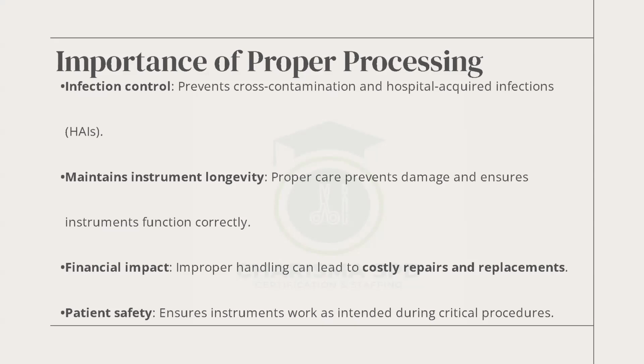All right, and patient safety. If you don't process the complex instrument well, you cut corners and you leave microorganisms or bioburden, you infect the patient, and then the patient has to come back and can sue the hospital, so the financial impact comes into play, and the life of the patient is also being impacted negatively. So when you go to the job, pay attention to complex instrument reprocessing.